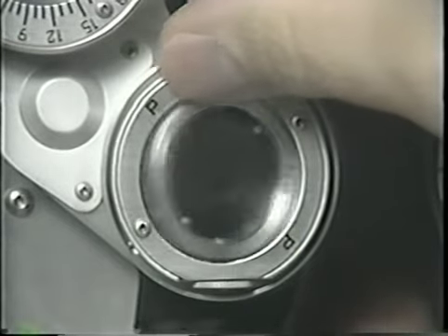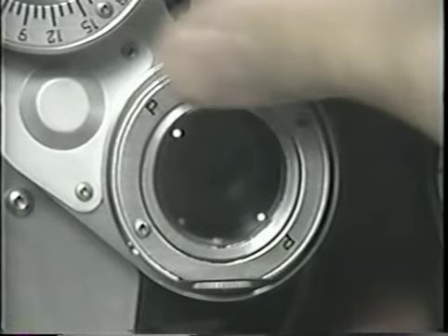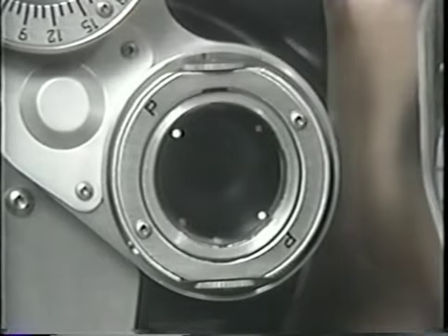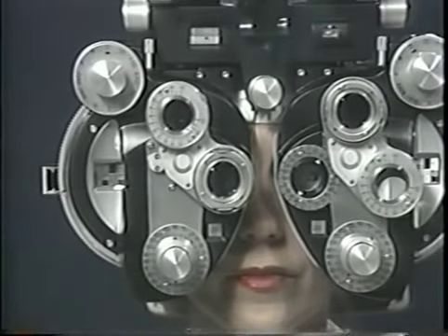Now which is better, 3 or 4? 3 or 4? 3's better. 3. Good. The cross cylinder in the preferred position indicates that plus cylinder should be added with axis 135 or minus cylinder with axis 45.